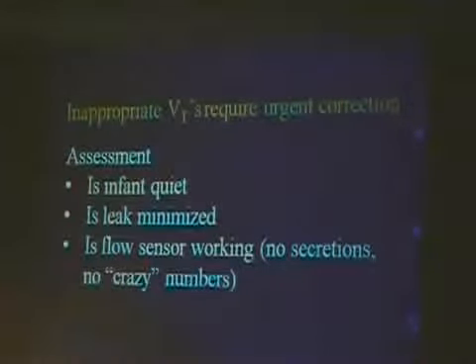Well, that was not even, I don't think, possible. We also have to be sure the weight is put in correctly. I forgot to put that on the slide, but that's absolutely critical. Sometimes therapists may forget to put the correct weight in, because if the correct weight's not in, you're going to get an inappropriate response.